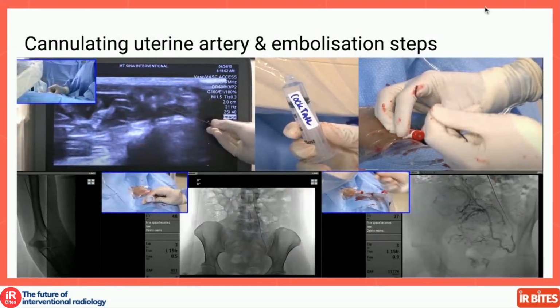So this is a picture of radial access. So I thought I'd show you this. The radial artery is cannulated, and then a specific thing for radial artery is you use a radial cocktail, which is a mix of a few drugs in order to prevent spasm. So there's a calcium channel blocker and a couple of other drugs which I never remember the doses of, but that's given to make sure that you reduce spasm, because it's a smaller artery than the femoral one.